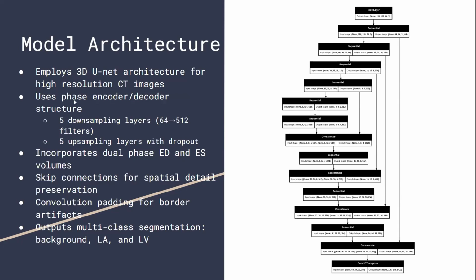All right. Hi. So I'll talk about the model architecture. This is the U-Net that we're using. It's pretty lightweight. I think Jason talked about it a little, and I think he's using the 2D one. We employed a 3D U-Net. To change it to 3D, we just make the functions inside the 2D U-Net 3D, and that way we preserve the through-plane anatomical continuity.